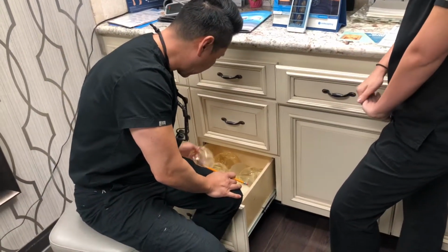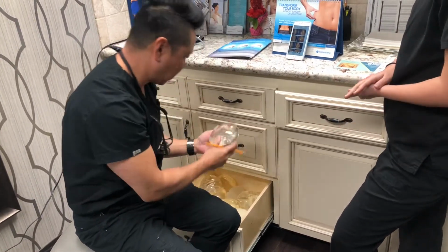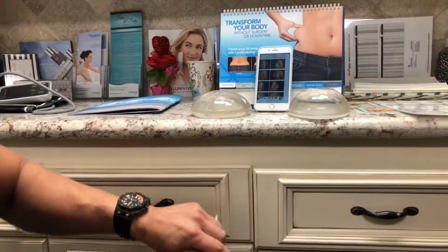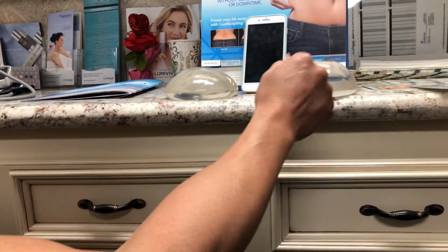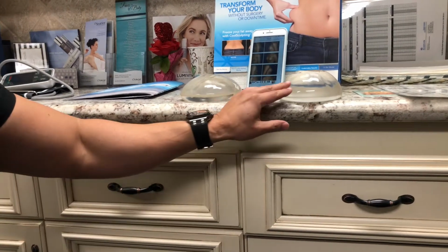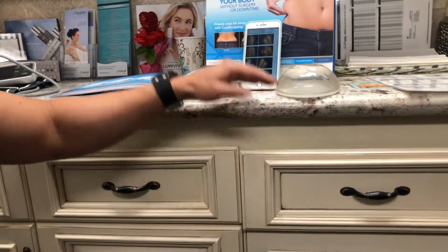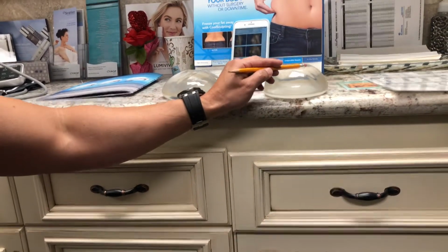The second thing that we're deciding now is the cohesivity of the implant. Just to keep it simple, soft, medium versus cohesive. If you look from eye level here, you can see that this is the fullest projection. Most women want some definition and cleavage, so most of the time we'll go with this. This is the softest, called the Inspira, where we see a little bit less fill here.